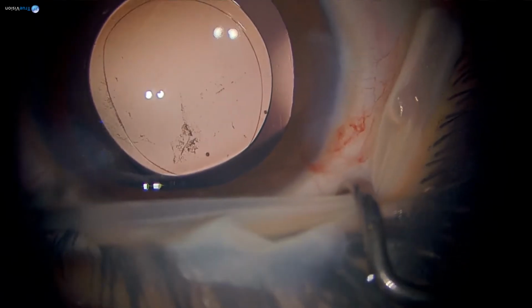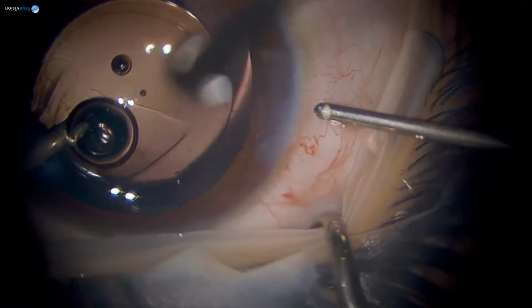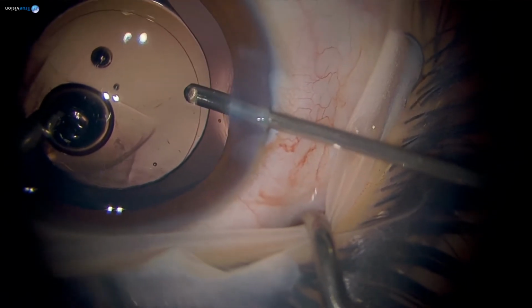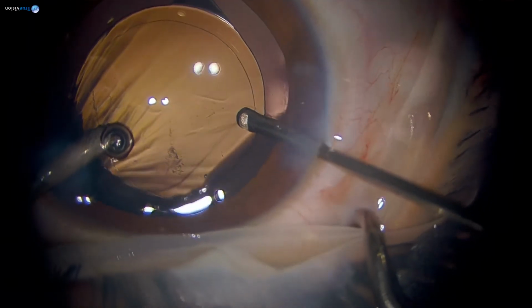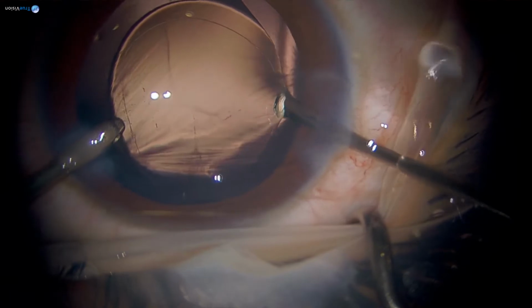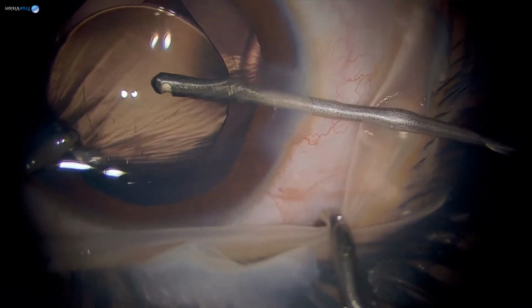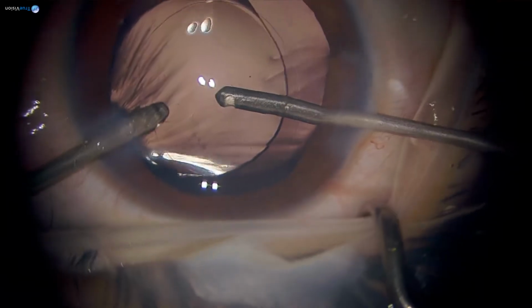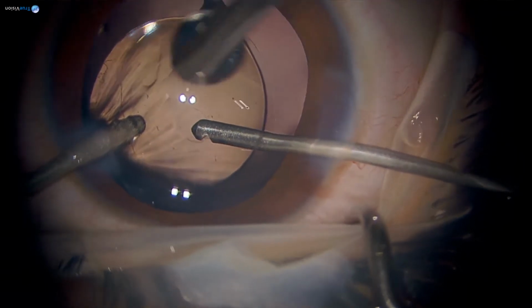We are at the linear 3000 cut, right? So my cut rate varies between 1000 to 3000. This is a linear cut, which makes my life easier. I have total control to go between 1000 to 3000. This is an important step. I'm going behind this capsule, pressing the IOL there, and then the probe comes here, and that way the eyeball moves a little bit, the lens moves a little bit, and then I start the capsulorhexis.